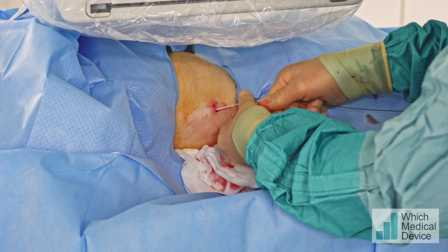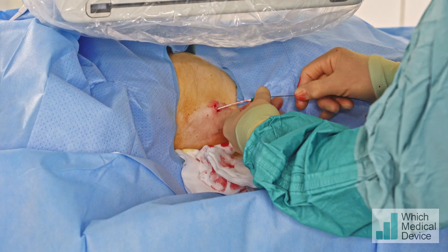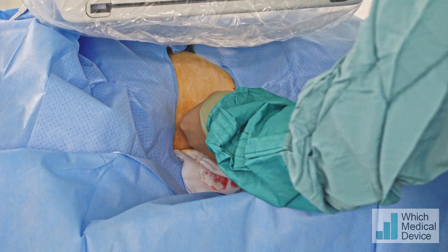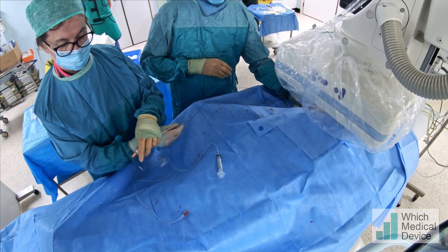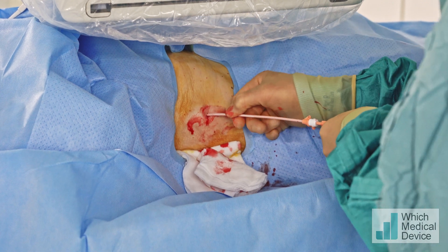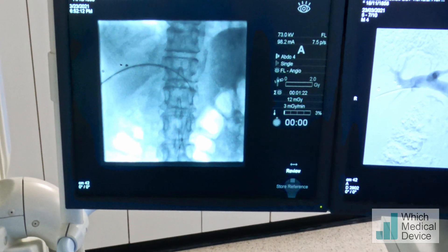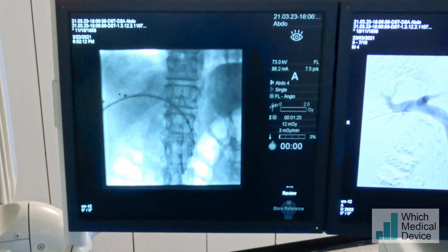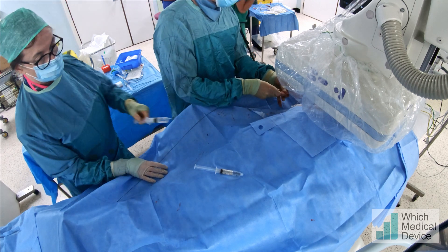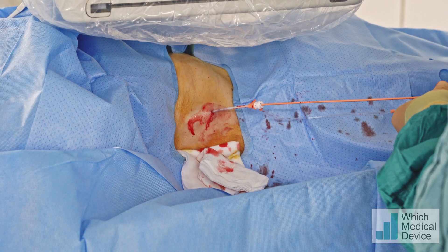The Benson wire is just going in. Are we ready? We're ready with the sheath — we've got plenty of wire in. The Goldstick is coming out and we'll pop the sheath in. Just going to screen that sheath in. I'm going to take the inner bit of the sheath out and leave the wire in, because if you leave the wire in it helps to keep the end of the sheath off the wall of the portal vein and you actually get better flows of the islet cells.